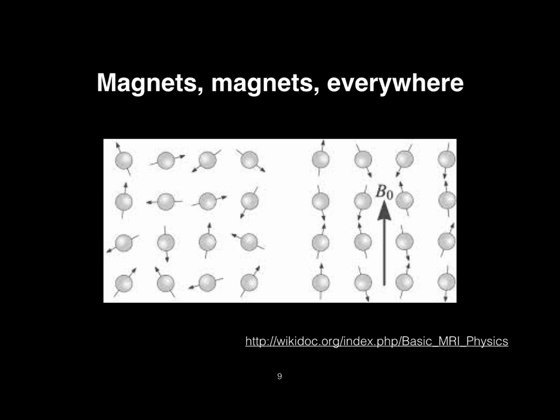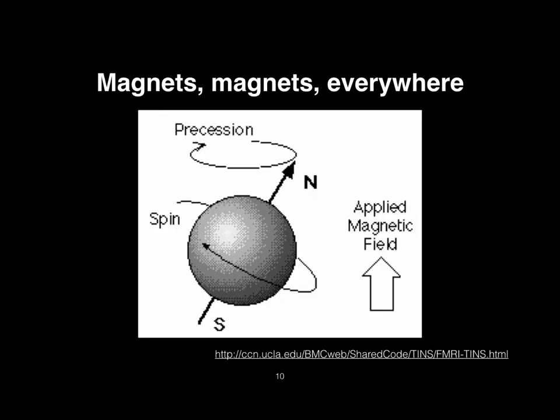So are people familiar with the concept of taking a strong magnet, putting a little bit of iron next to it, and then the iron itself becoming magnetized? And then this in turn can go pick up or attract other things itself. Same idea here, except it's at a much weaker scale, and now we're looking just at the nuclei. But the magnets that we're using are so strong that when you put something containing these magnetizable nuclei into the field, they create a tiny little net magnetization itself.